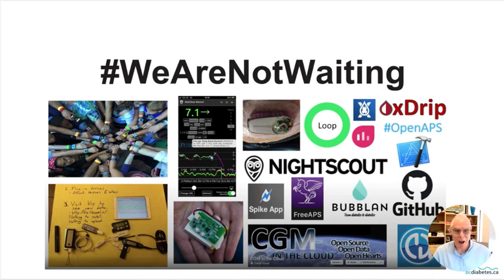And how is it that it's been available before a retail version? It's because of the open source community, which is a cooperative. You can see the hands joined over on the left. You can see the names of various organizations. GitHub is where all the programs are stored and downloadable by any person who's a member of GitHub.